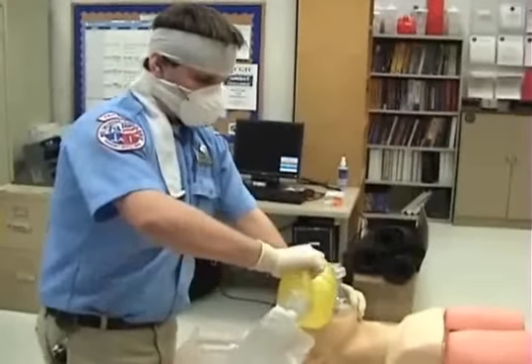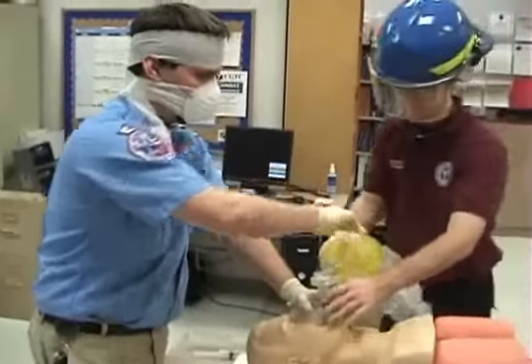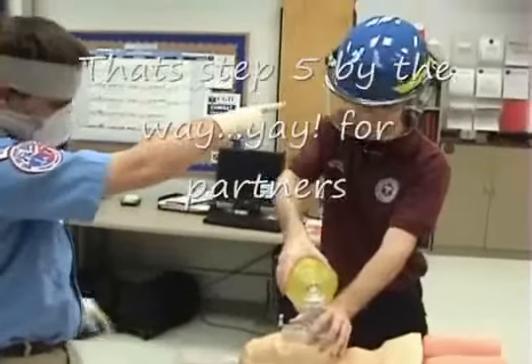At this point, we will turn oxygenation over to a partner. Notice he's wearing PPE as well.